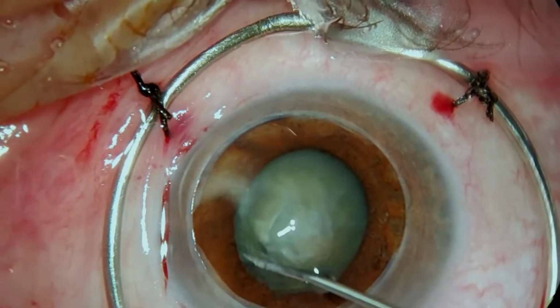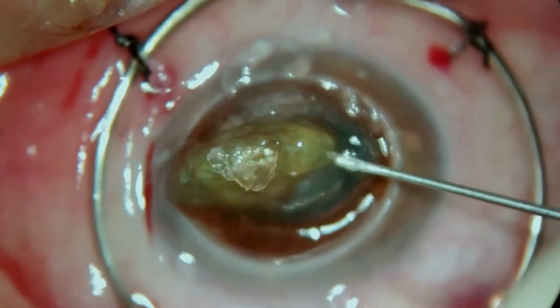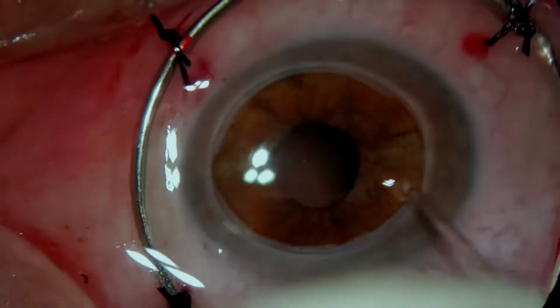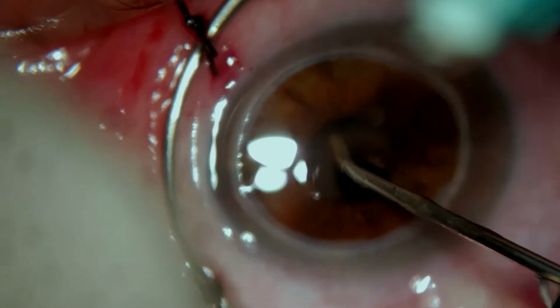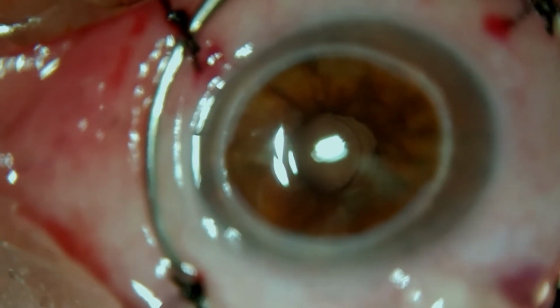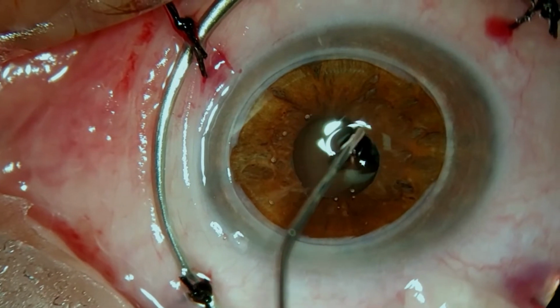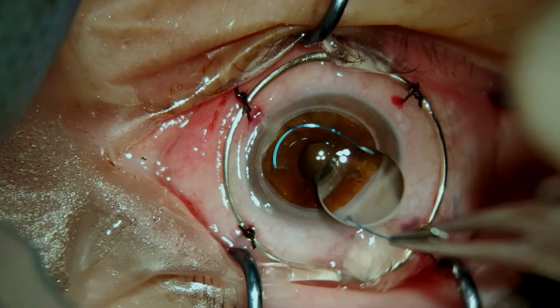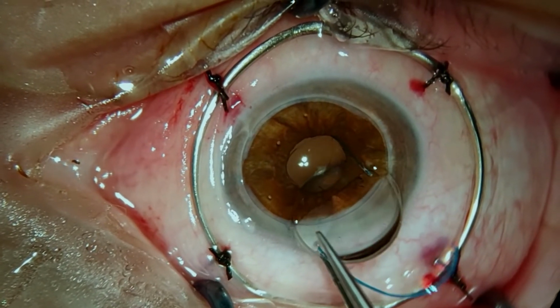Then we go ahead and do the hydrodissection, which most of the time expresses the nucleus in whole, with an important part of the epinuclear shell and the posterior cortex. We then wash out any cortex that was floating around, and we proceed to aspirate the peripheral cortex. Now, in this case, we should have done it with irrigation aspiration on, but it wasn't on hand. So what ended up happening is that we pulled on the posterior capsule and made a rent. But in this case, just pulling on the capsule did not break the anterior hyaloid, so we have effectively no vitreous prolapse. We stop, we leave the residual cortex as is, and implant a 3-piece MA lens.